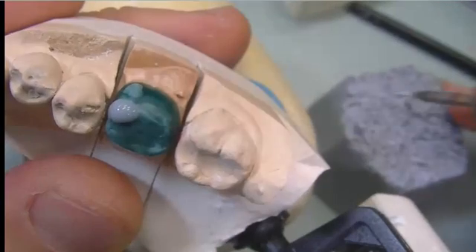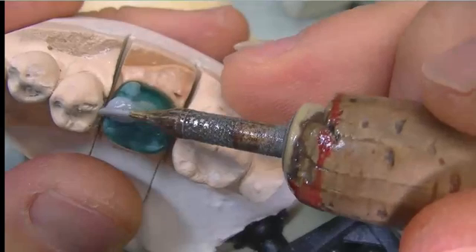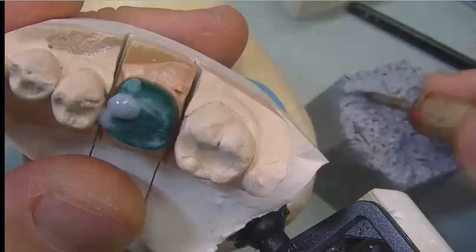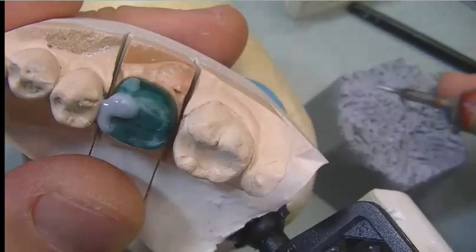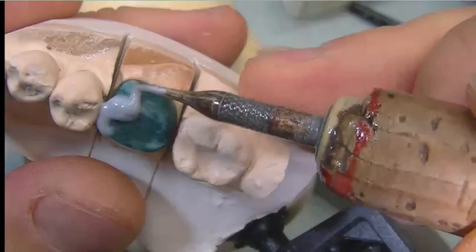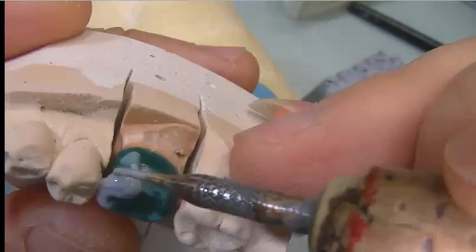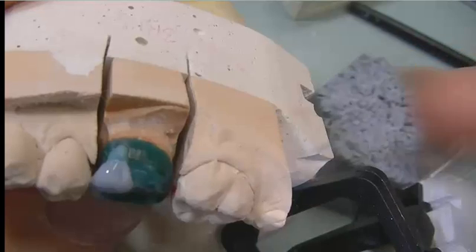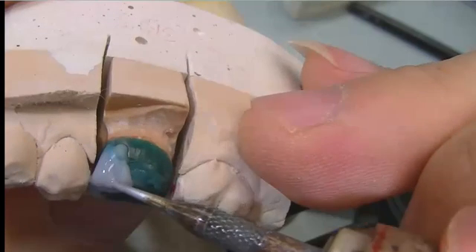Here we are waxing up the mesial buccal cusp. We add some wax on the marginal ridge, and continue waxing up the mesial buccal cusp.